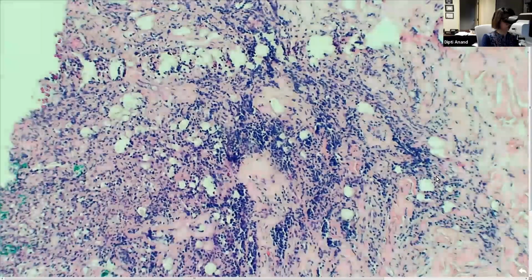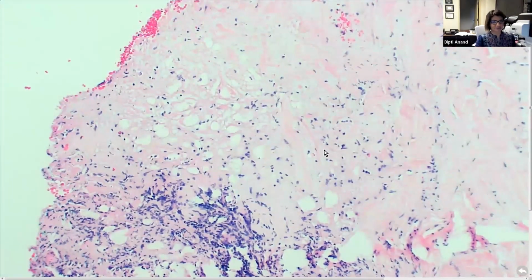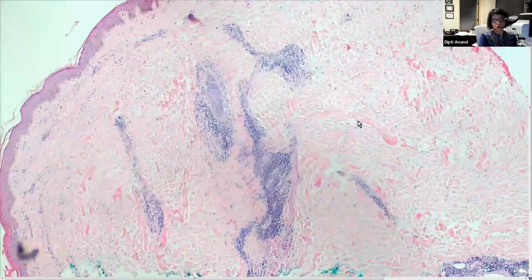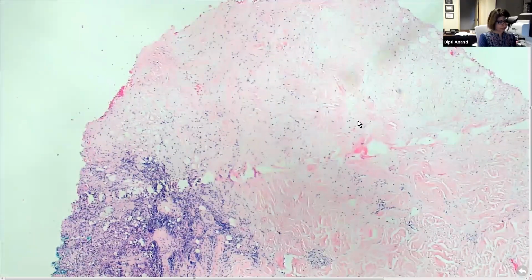And what's happening to the fat in here? Oh, you're getting like lupus panniculitis. Exactly. You can see the nice hyalinized fat necrosis with lymphocytes within the fat, and you can see the really pink necrotic fat in the background. So this is your lupus profundus or lupus panniculitis. And you will always see the superficial and deep perivascular lymphocytic infiltrate, which is also within the fat. You get it?